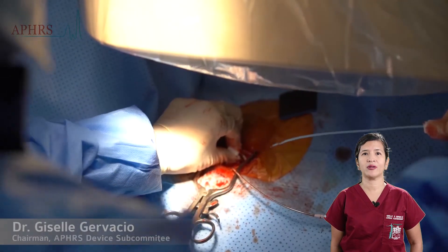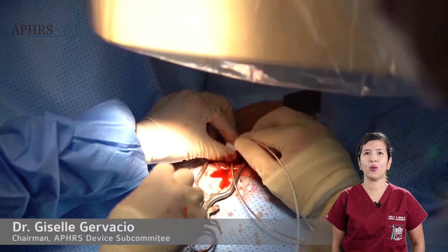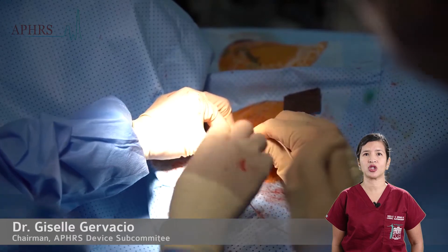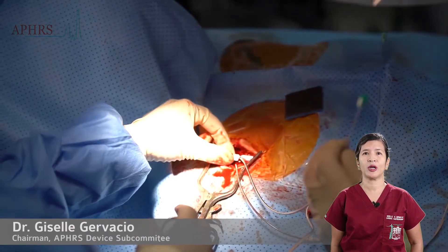The dilator and guide wire are removed. The tip of the sheath needs to be pinched while negotiating the introduction of the lead into the sheath, to avoid air entry into the bloodstream.